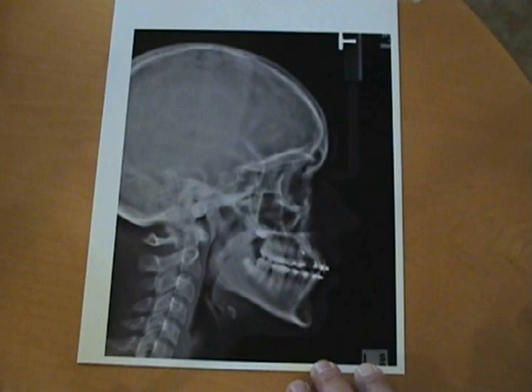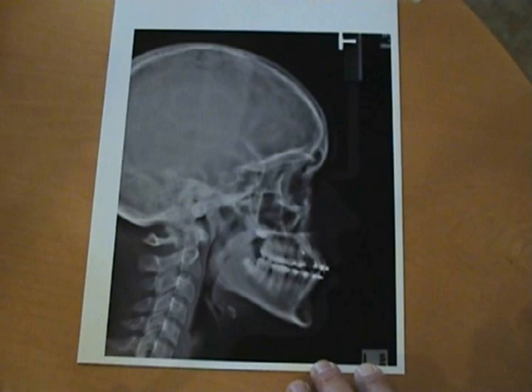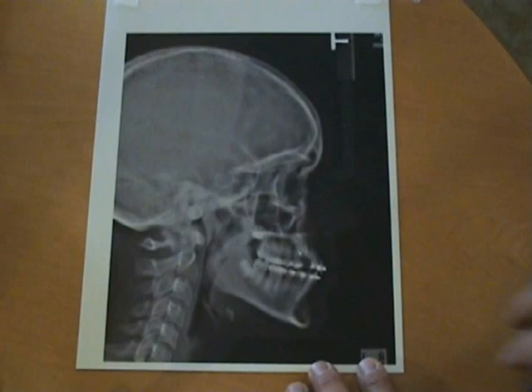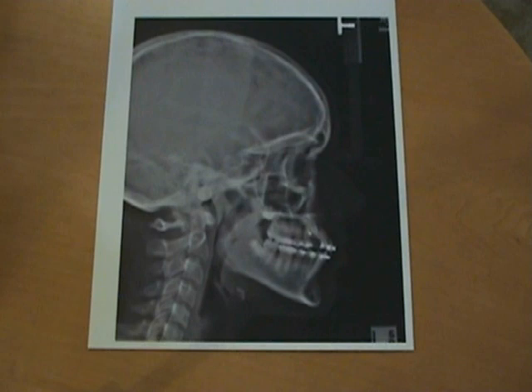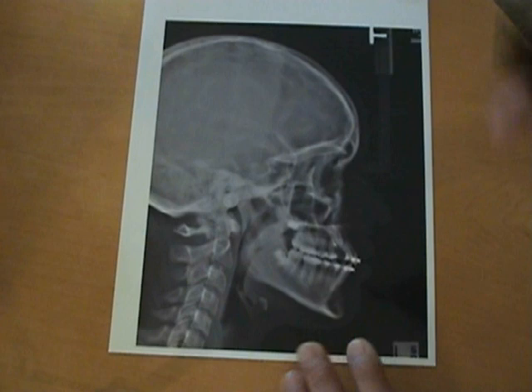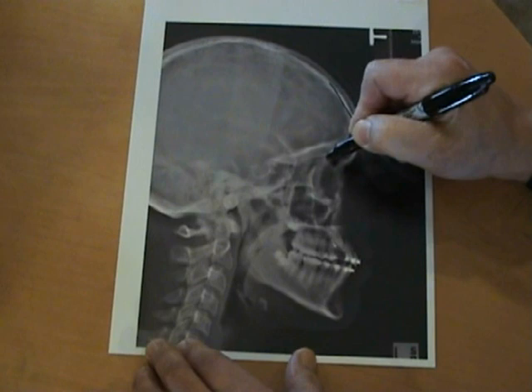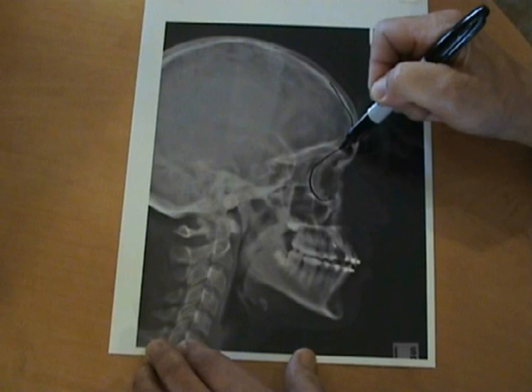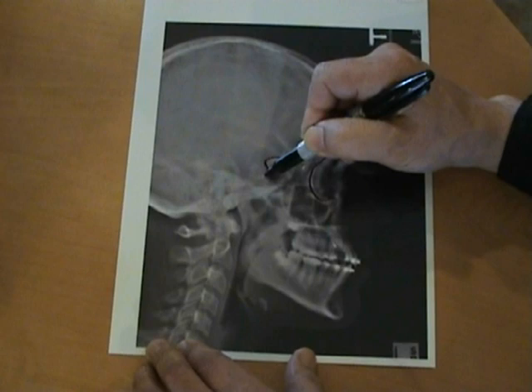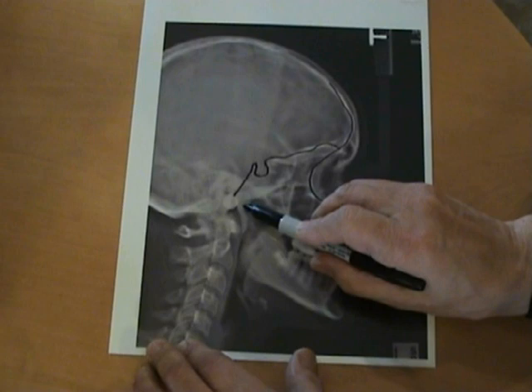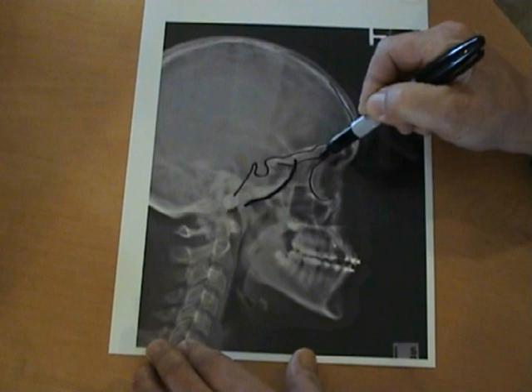I like to tape a clear acetate over the cephalometric radiograph. I would like to use a magic marker to trace the anatomy. This is the cranium, and this is the lateral border of the orbit. This is the roof of the orbit. Sella turcica. Greater wings of the sphenoid. Cribiform plate.